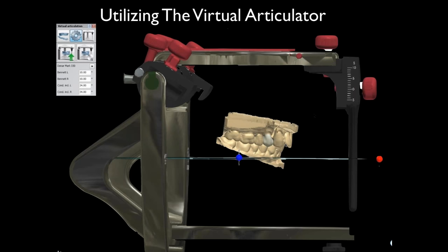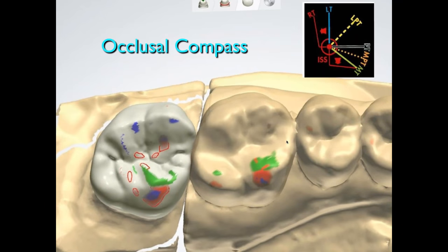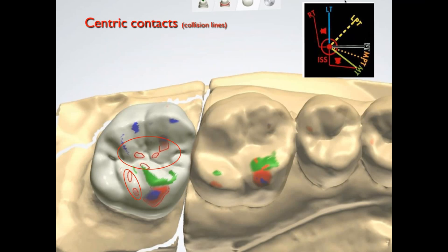Now that we've gone over the preliminary stuff, let's talk about the actual virtual articulator and how to use it properly — initially with full arch articulator-mounted models. This is critical because that's what it's designed for: full arch cases mounted on an articulator, where you have them in real life in the same position as in the virtual world. The occlusal compass is in the manual to show what the colors mean. Centric contacts are shown as collision lines. Blue is a lateral movement — a working interference — meaning you have contact in lateral.